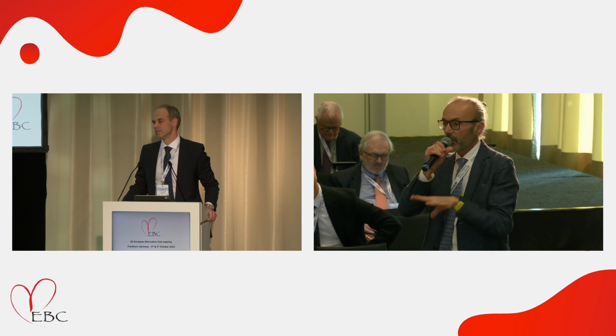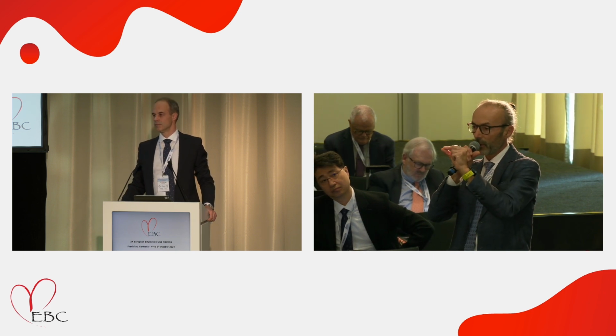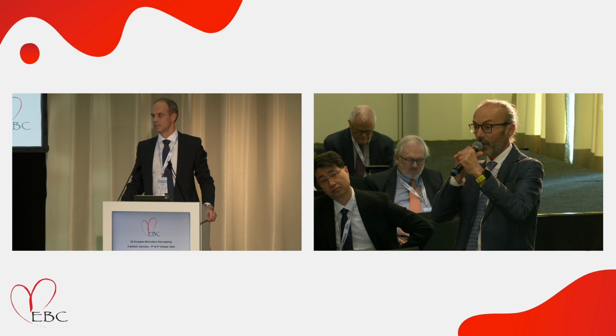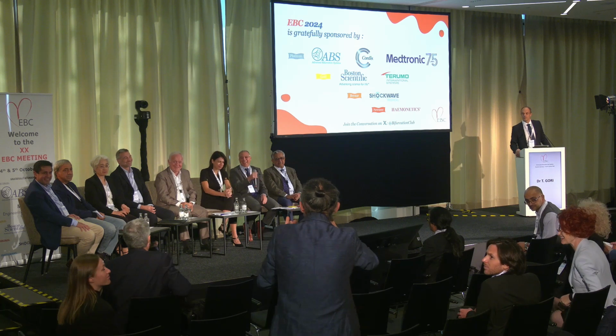This way, you have just a neocarina, which is 1 or 2 millimeter, which is crushed. And you crush directly, doing the kissing immediately. So the crushing is done with the kissing immediately. In addition, you can explain why you have more side branch size, because when you re-enter in the side branch, you re-enter through the stent true lumen. Do not get too enthusiastic. Yeah, no, but this is the secret.